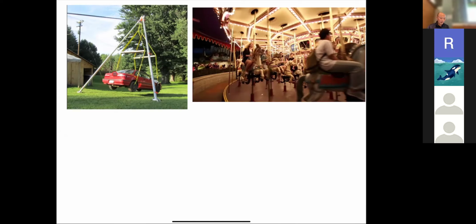The same thing is if you imagined your friend was at a carnival or some amusement park and you are sort of here and you have a thread attached to them, right? And I say, I'll give you $100 if you can pull your friend off the horse, right? So this merry-go-round's going around, right? So clearly you're going to have to run around with that person and exert a very faint pull. And if you do that and you can stay exactly the same frequency as the person, then you could have a chance of pulling that person off, right? That's essentially what we're doing with the RF field.